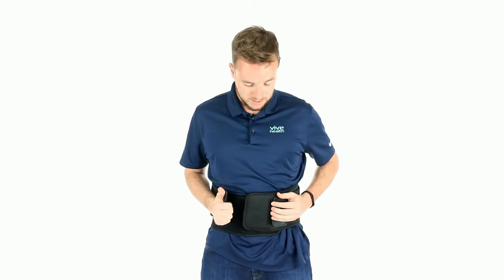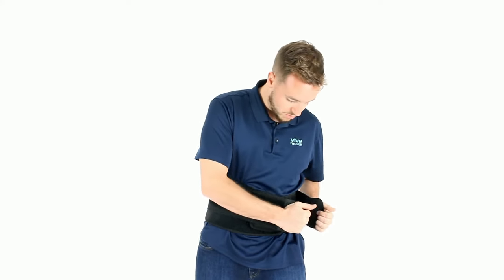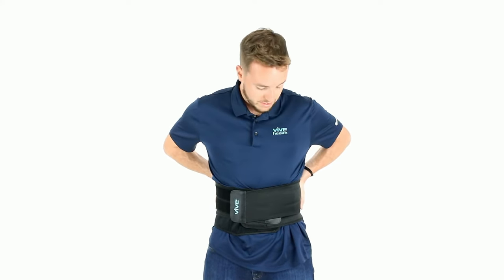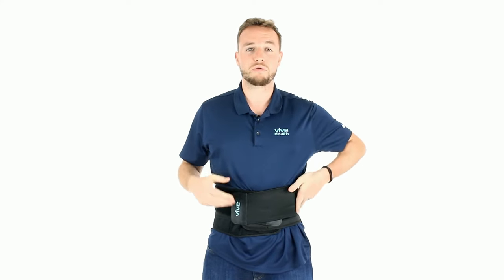Tighten that up pretty tight, and then you're going to take these two here — take the one on the right first, cross it across your body and velcro it in, then the one on the left. Now you have a stable back brace. It is the best combination of price and quality in the market, bar none.